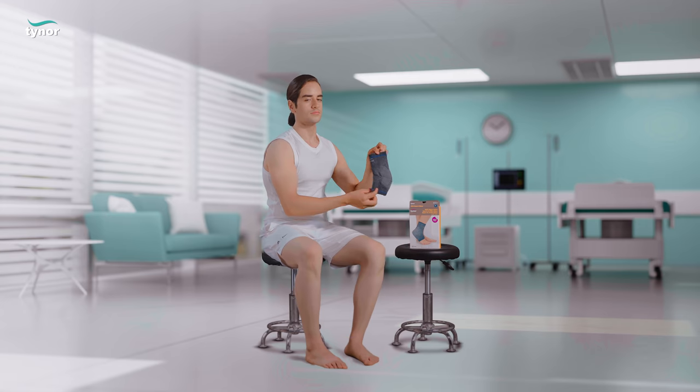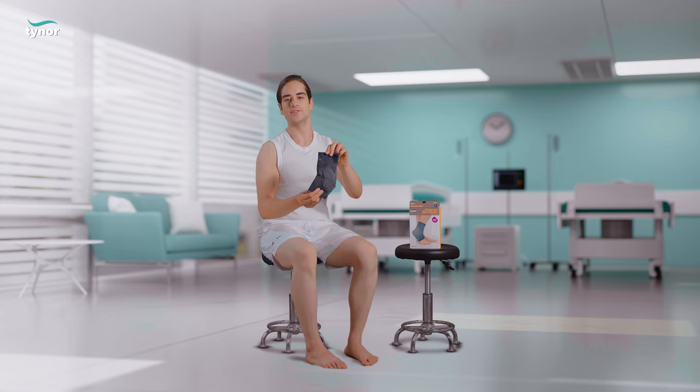Hi everyone, this is Tynoor's ankle support urban.